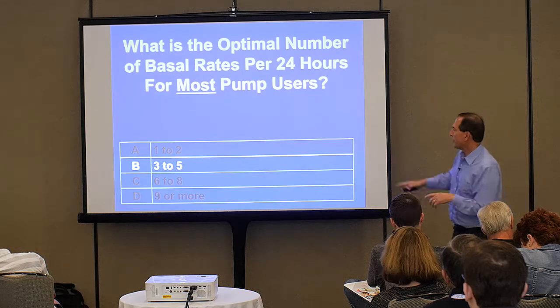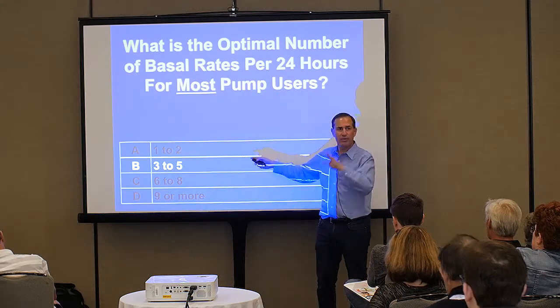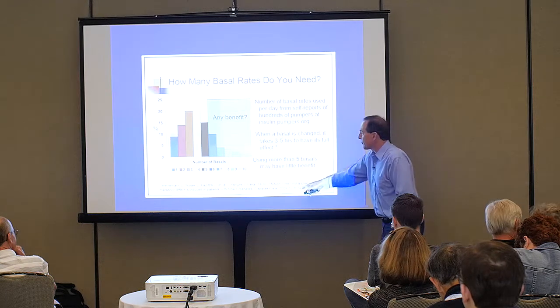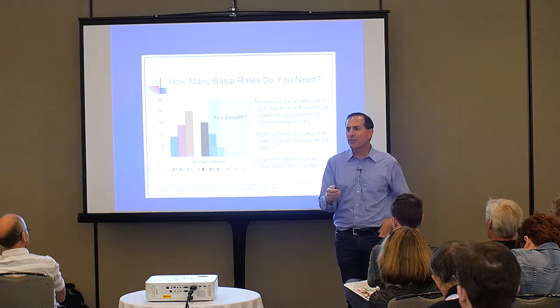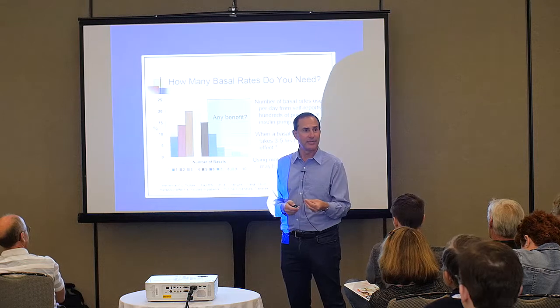So in general, 3 to 5 is as much as you need. Now, if you find fewer work better, great. If you need more, that's great. But in general, that's enough. And that was looked at in a research study from a whole bunch of years ago, and it found that once you exceed 4 or 5 basal rates per day, you're not really giving each of those basal rates a chance to work. They're not active long enough.